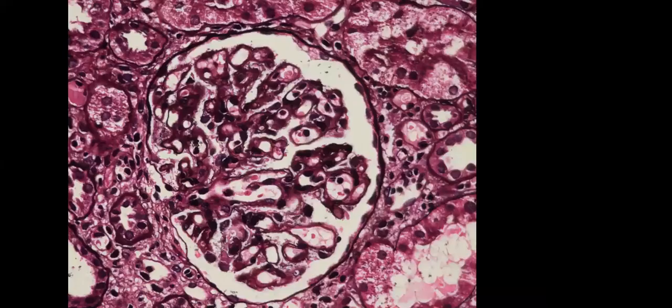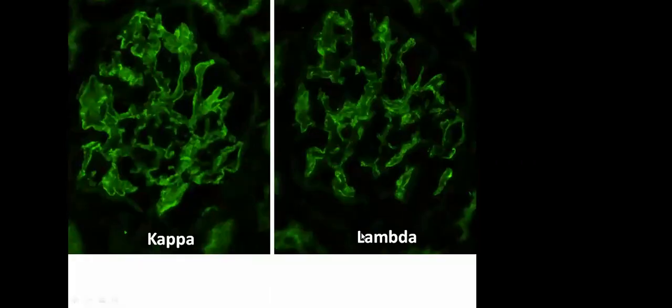This was a case post-transplant with proteinuria and no significant renal dysfunction, and it showed C4d, which was positive in the peritubular capillaries and also along the glomerular capillary loop. But there was IgG also, which was showing minimal granular staining. With IgG subclass, it shows dominantly IgG4 subclass, and there was some IgG1 also.